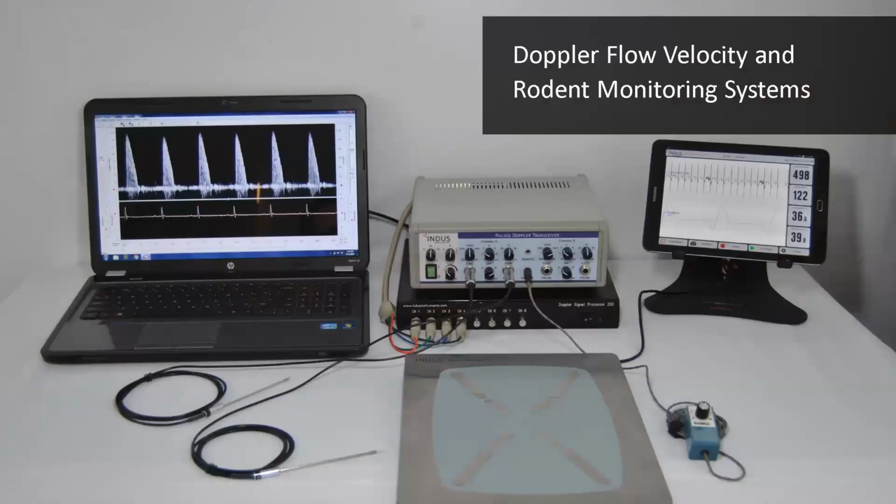Shown here is a simple setup of the pulse Doppler system. Here is the ECG board onto which the mouse will be taped. The ECG can be observed on this tablet as well as sent to the Doppler program. Here is the Doppler system, where you use the probe, and this is the remote control where you control the depth at which you are listening to the echo, and the signal will be displayed on the screen.